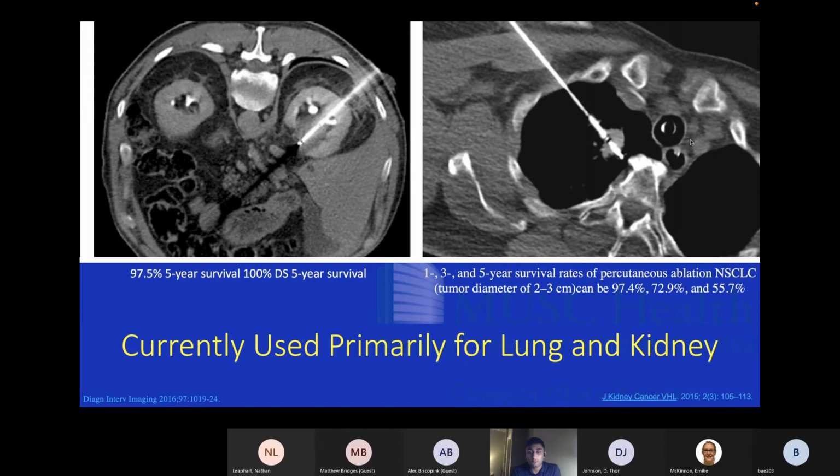And then the other beautiful thing about this relative to SBRT is when you have this lung cancer, as I told you, they originally didn't like us too much because we weren't getting them tissue so that they could do any kind of analysis. Now, especially in the age of molecular medicine, we see these lung tumors, and this happened this week in Tumor Board. They said, okay, we need a biopsy of this one and this one, but then we also need to treat these. And I said, well, I can biopsy and then immediately ablate through the same hole that I did the biopsy. Obviously, that was a very attractive idea to them because I can do both lungs. I can do multiple lesions.